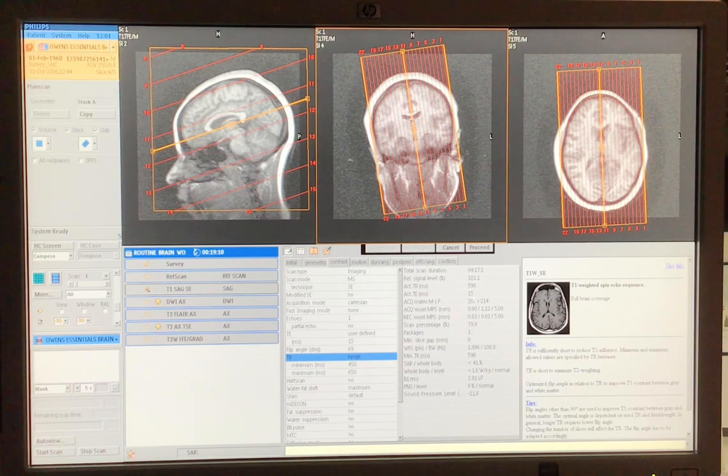Okay, my question earlier was just about the TR numbers, the TR and TE numbers, because since we've been practicing, she's been telling us that it's solely up to you, but we haven't heard anything like what numbers you want us to do. So that was pretty much my question, but you kind of got to it right now. Yes, okay, that's okay.